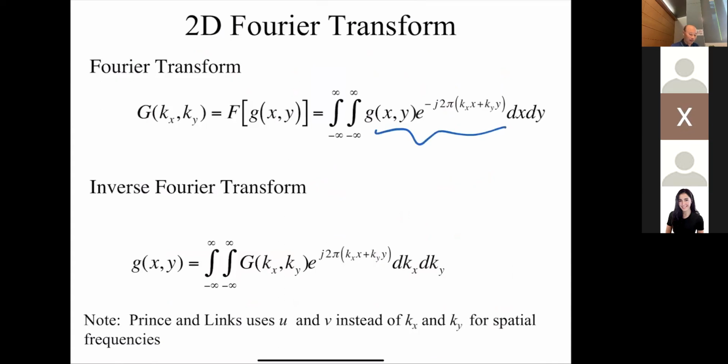We have my object and I impose a spatial pattern on it. Now, mathematically, this is a multiplication, right? But in MR, it's not like we have some multiplying thing. It's not like there's a calculator we put into the object. The way we do the multiplication is we just make the spins at different locations be in different orientations. So that's essentially that multiplication.